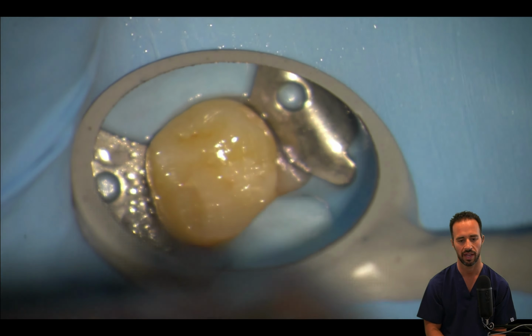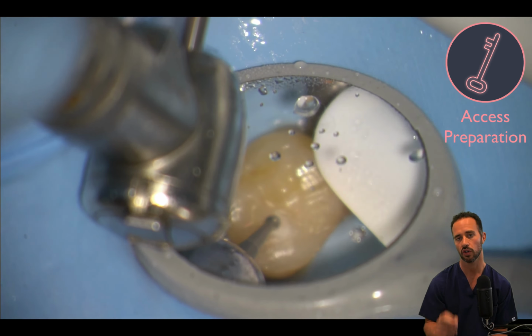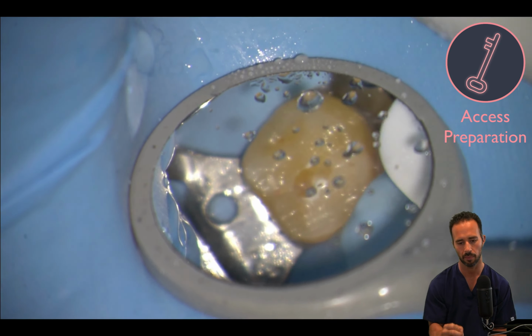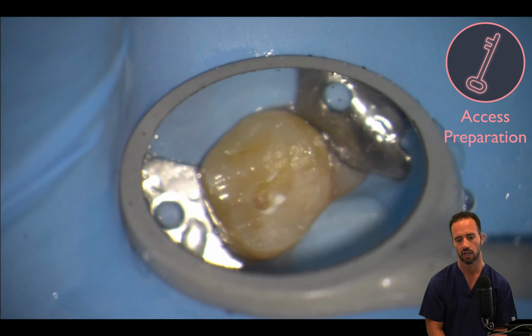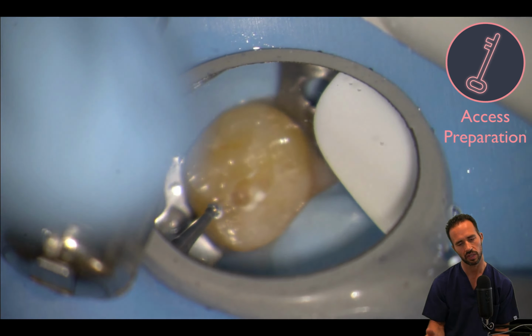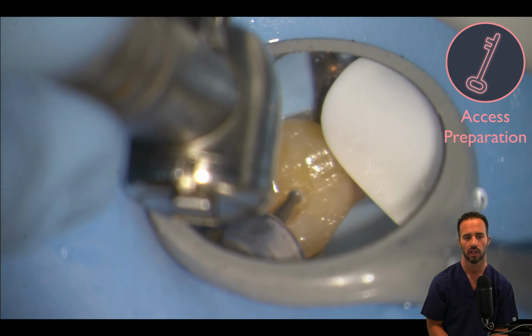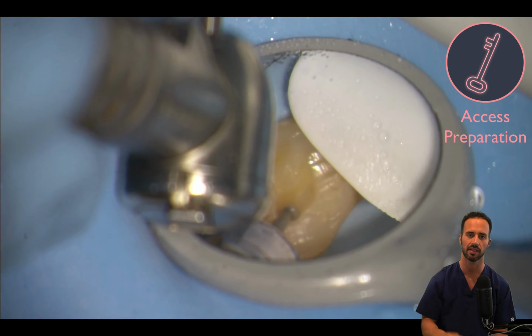And then we're going to go ahead and proceed with our access preparation with our size 4 surgical length round burr. And remember, when you're performing your access preparation on these upper molars, you're very rarely going to need to cross the oblique ridge. All right, so you want to stay within the confines of the oblique ridge, and you don't want to go too mesial either, because there's curvature on the mesial in the cervical area of the tooth towards the center. So if you go too mesial, you'll discover that you're actually going to pop out underneath what's in this case a composite restoration.